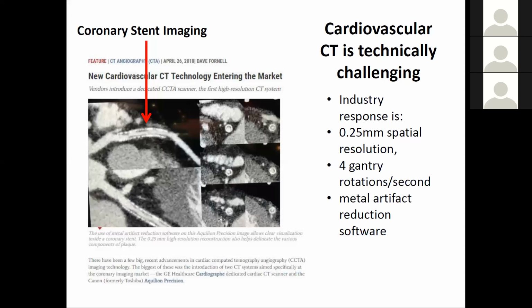So that's where your hope is with machine learning: it's going to be more robust against that, more supportable and faster. So there's a lot of potential for metal artifact reduction, and you'll find papers on it. All this stuff is so new that within the last year or two, you'll see the first big paper on metal artifact reduction by neural networks, and it's pretty good. So it's nice to see that. I've been in this area for decades, and this last couple of years has been dramatic.